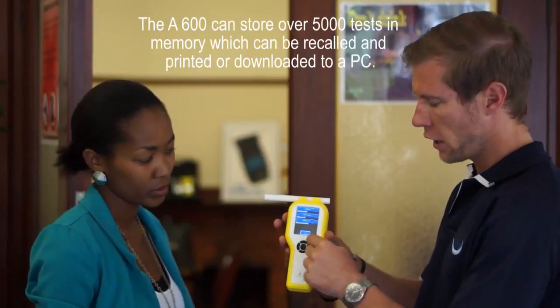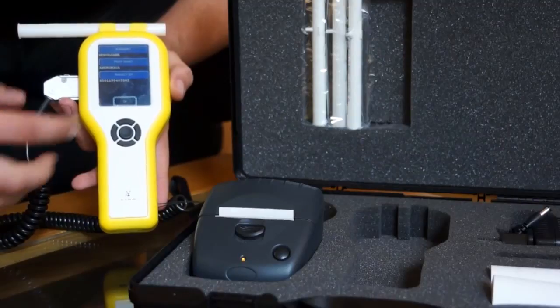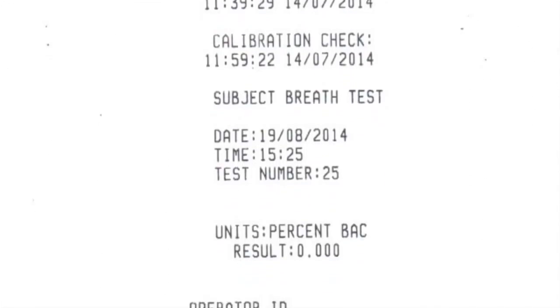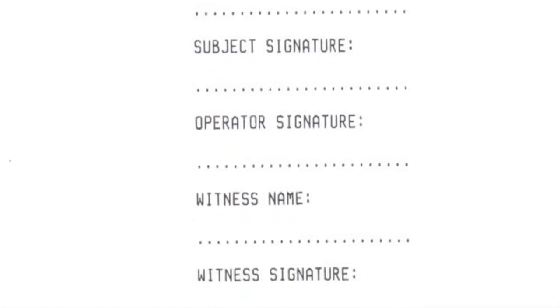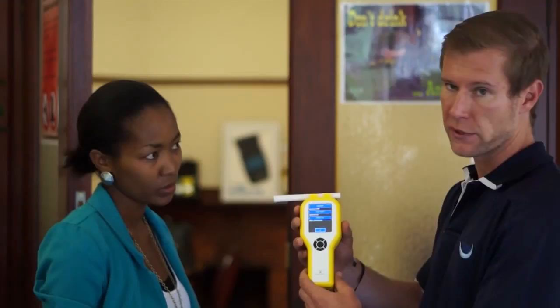Before we push okay, we're going to connect our printer to the side here. And as soon as we say okay, it will give us our printout. Or if it's not connected to the printer, we can say okay and it will save this test.